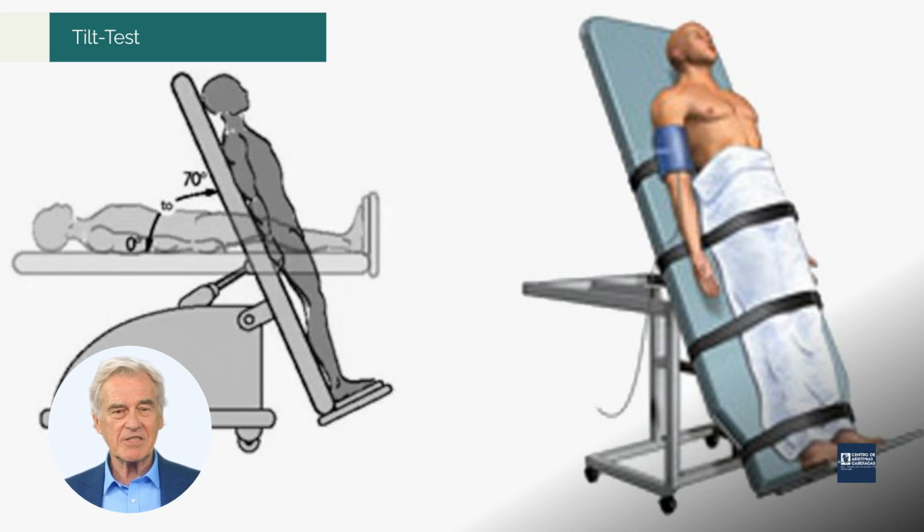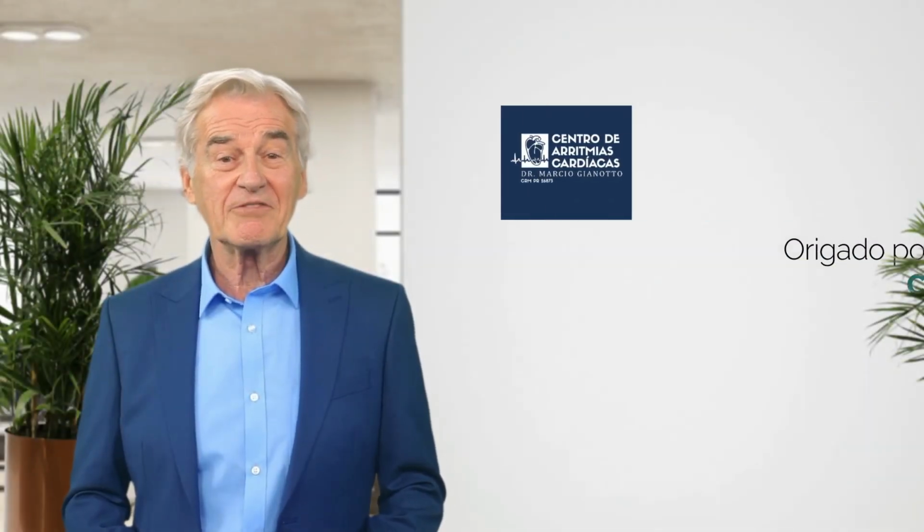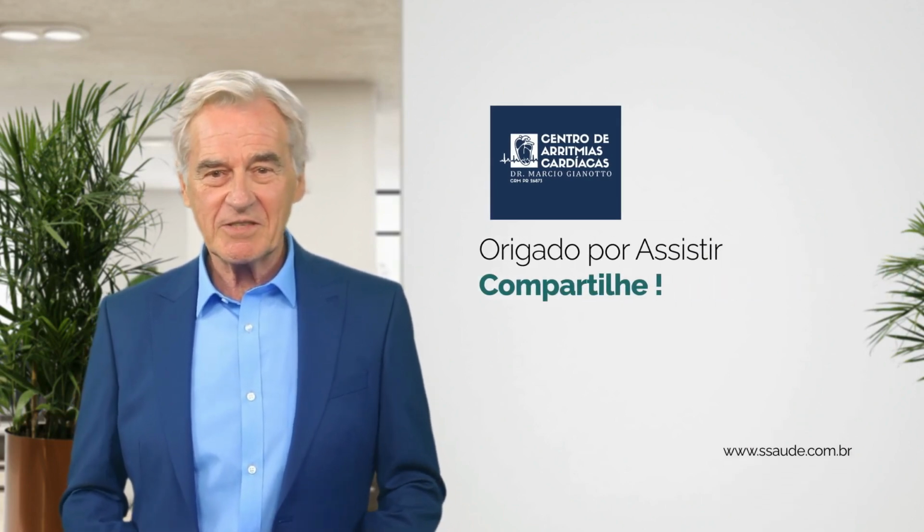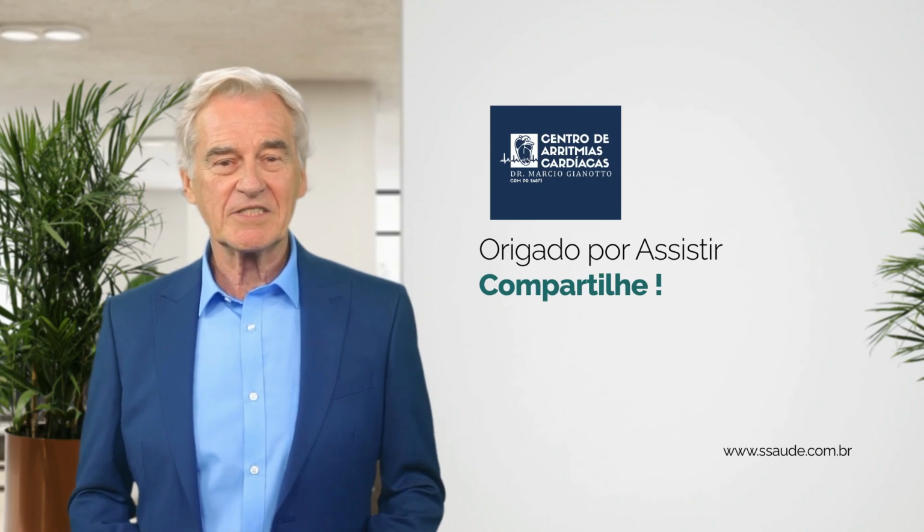If the examination proceeds without incident, the patient will not experience any symptoms and will be able to return home without any discomfort. On the other hand, if the test reveals abnormalities, the patient may experience symptoms like dizziness, nausea, or even fainting. As a precautionary measure, fasting is advised prior to the exam to mitigate the risk of aspiration should vomiting occur. Finally, it is important to emphasize that the tilt test is a safe and very important exam to identify the causes of dizziness and fainting in patients with a history of these symptoms.